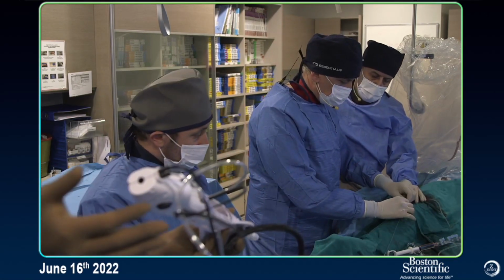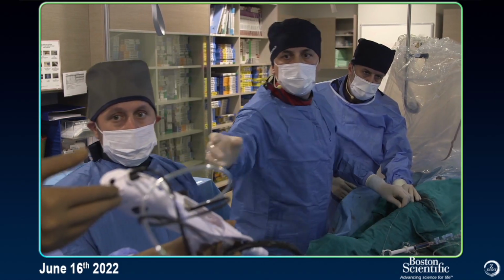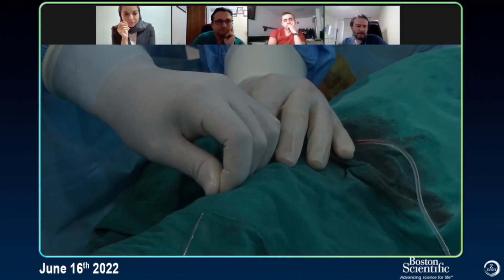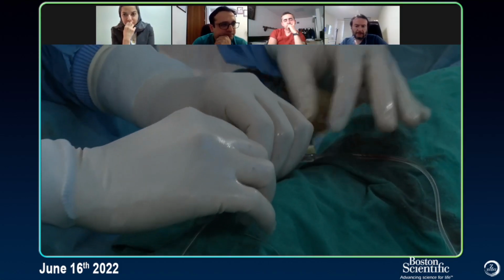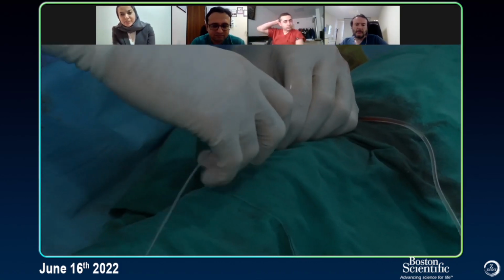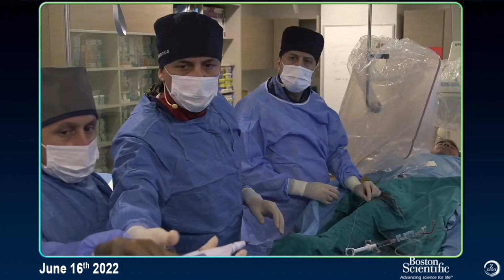Now, did you have the wire there? No. Not yet. And Ömer, can you give us some insight about your setup? Is it a radial procedure? Yes. 7 French, 6 French, 8 French? How is your setup? Seven French. We are working over a 7 French EBU by radial approach. Okay, a little bit more. Yes. Here. We will do some control.